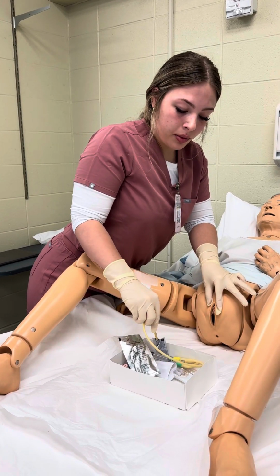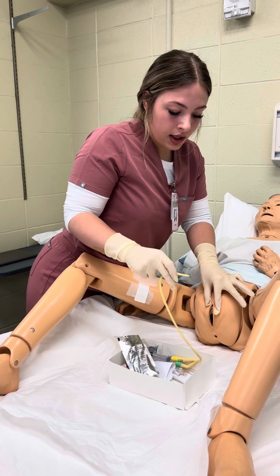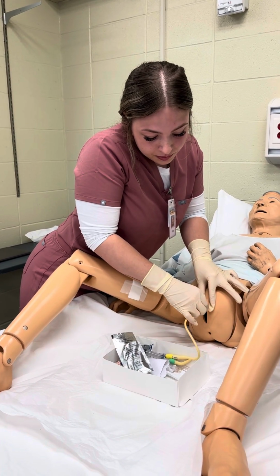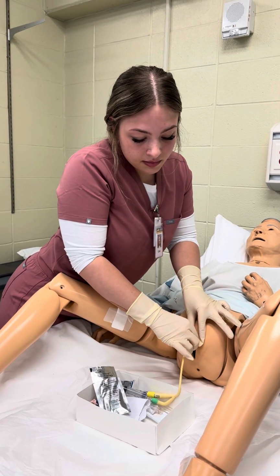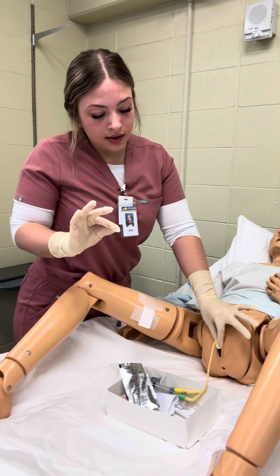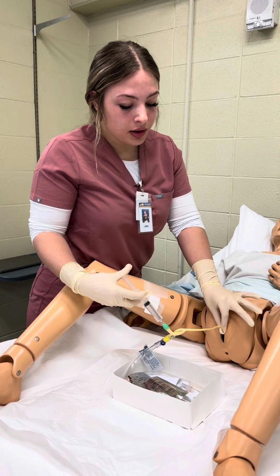Going to take my Foley and insert the Foley. And then once I see that urine return, I'm going to advance another 2 to 3 inches. Okay, and using my non-dominant hand to keep it stable, going to take the syringe and inflate the balloon.